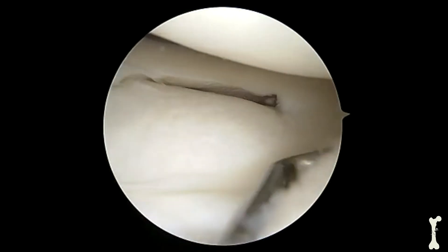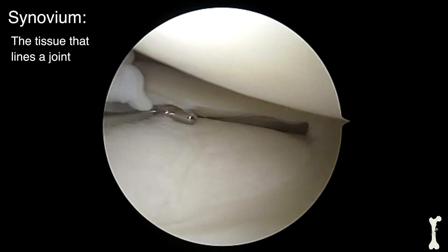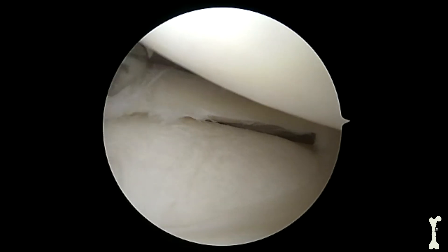For reference, this is a normal meniscus. With the exception of some synovium which has floated into our field of view here, the meniscus overall looks smooth. There's no tearing or displaced meniscal tissue.